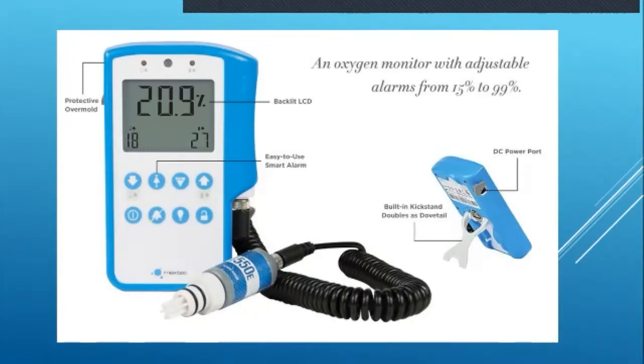You would stick this little head part right here into the stream of the gas, okay? And then it would tell you what it is. So right now, this is reading how much? What is this considered? How much oxygen is this? Where must it be? It's room air. Room air, 21, good. Brittany, it's room air, okay? 20.9%. Room air, 21%, right? See, it's not in any kind of oxygen flow, so it should be 20.9 or 21%.